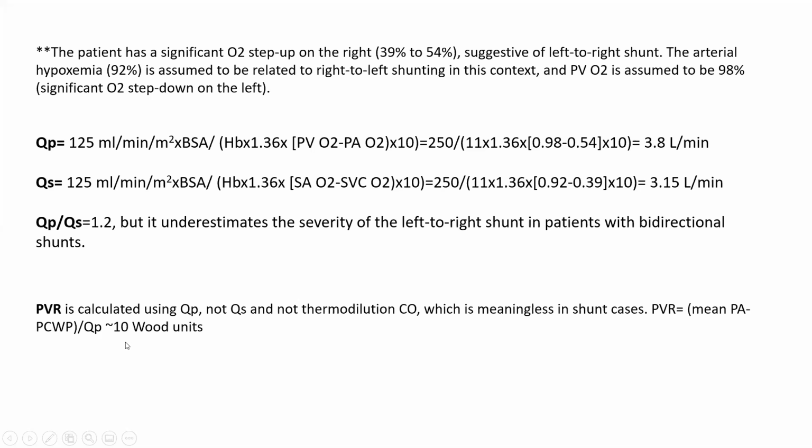For a shunt, over 5 is very high. So that was worrisome. So what's the next step in this case? Here, I think something Ahmed mentioned earlier. Here, it is very important to do vasoreactivity study. So the pulmonary hypertension is severe with severe PVR. I'm worried whether we can close it.